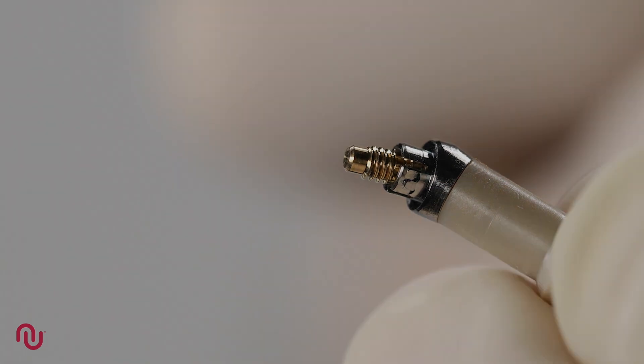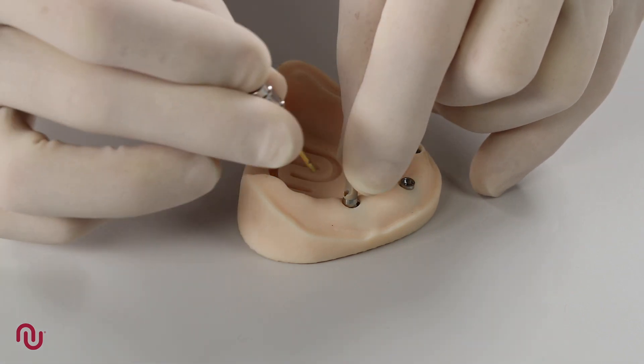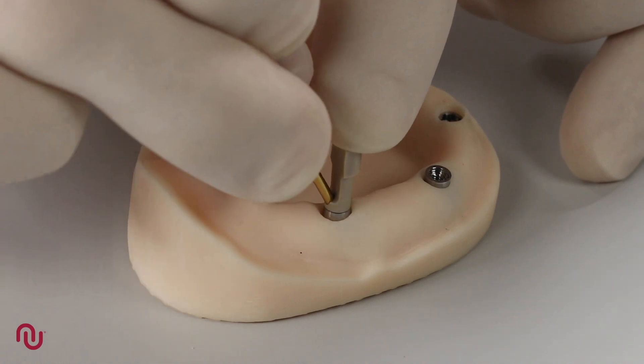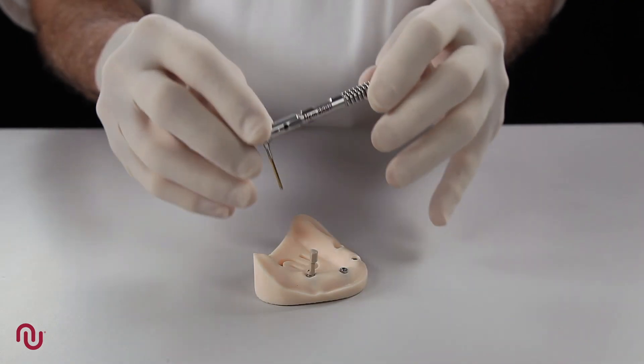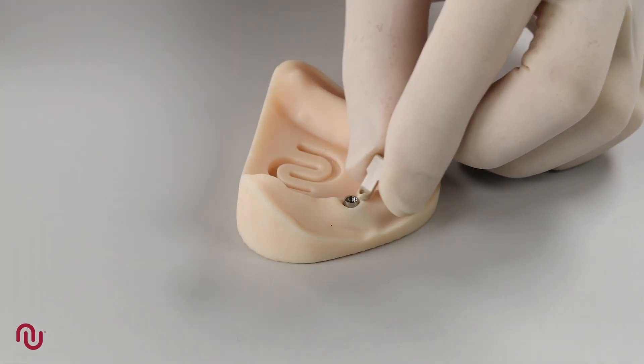To place an angulated access abutment, first engage the abutment into the implant and keep pressure on the holder to avoid rotation of the abutment, then hand tighten. The access abutment holder will give an indication of the screw axis of the final prosthesis. Once orientation and seating is verified, tighten to 32 Newton centimeters. The holder is then simply snapped off.